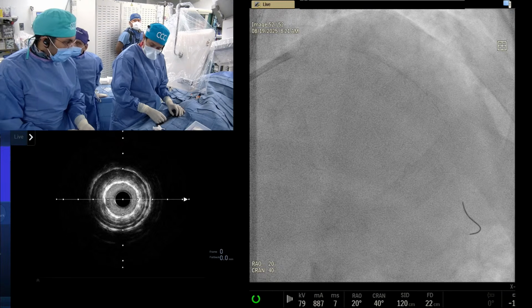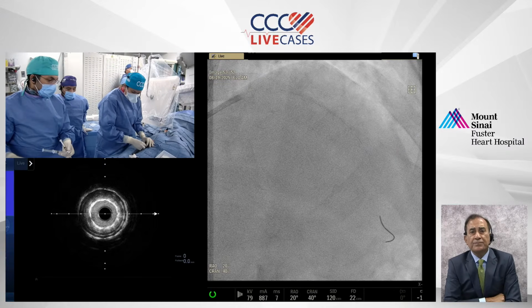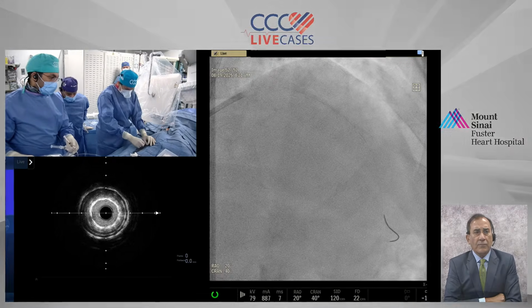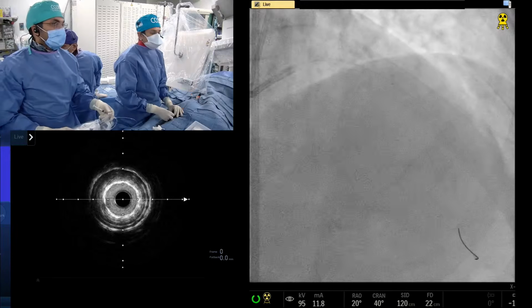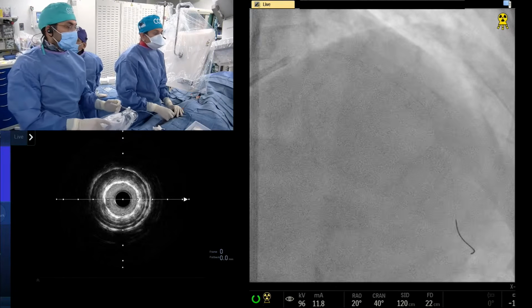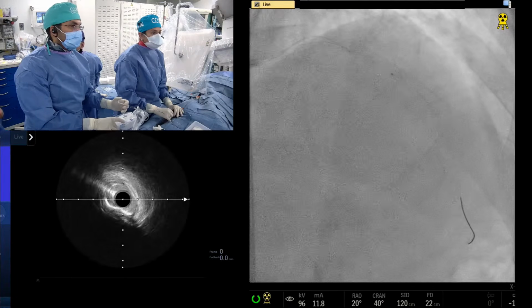So, how about dilating with the small balloon and going back with the IVUS? Well, if that's required, I would just go with the Rota. Right, but that's one approach. You are right, you do a 1.5 or 2 balloon, and then do the IVUS to understand. If that is the difficulty in our lab, actually, it's a very simple message. Okay.